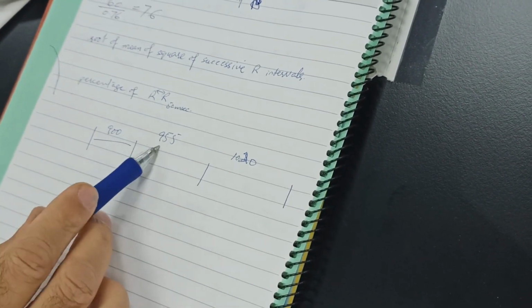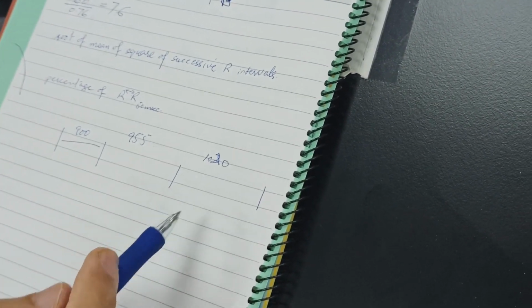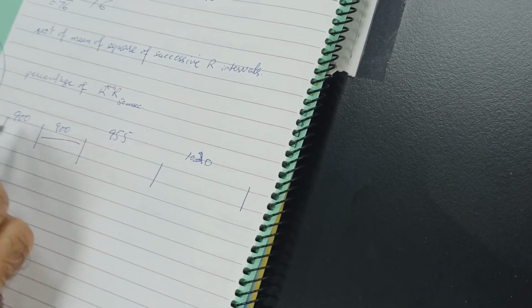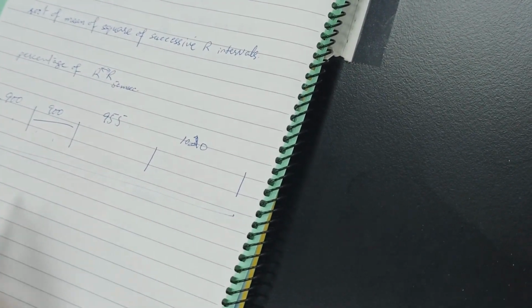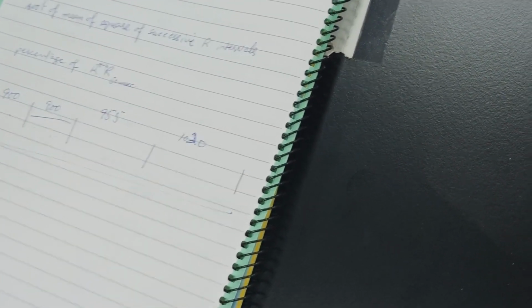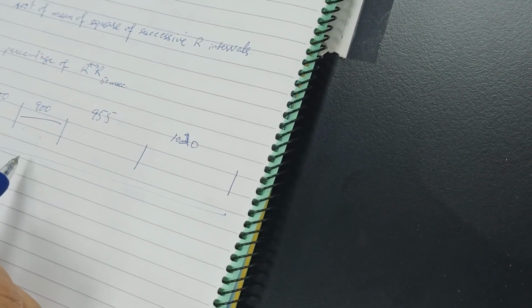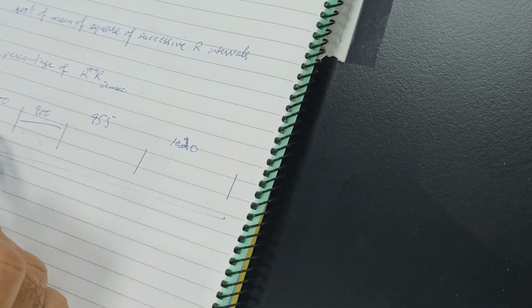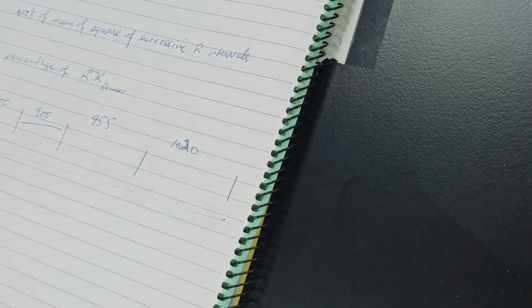The difference between these two is more than 50 milliseconds, and the difference between these is also more than 50 milliseconds. This one is also 900, this one is 920, so here the difference is less than that. Say we have got 5. Out of these 5, there are 2 intervals which are more than 50 milliseconds compared to the immediately previous one. So the percentage would be 2 out of a total of 5, so 40%. This will be automated.